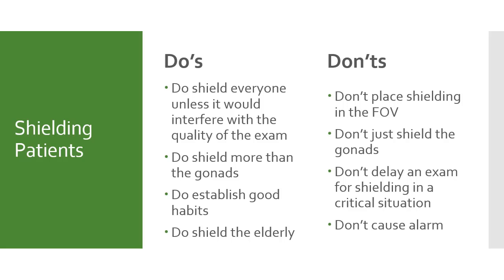The don'ts. You want to make sure that you are not placing the shield in the field of view. You also don't just shield the gonads. Again, you want to shield as much as you can as long as it's not obstructing the anatomy of interest. Don't delay an exam for shielding in a critical situation.